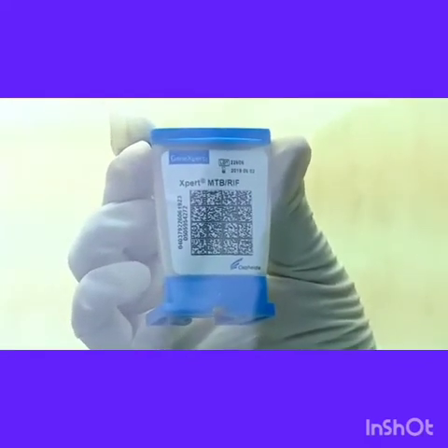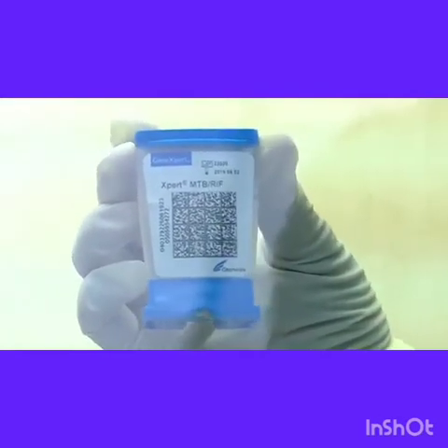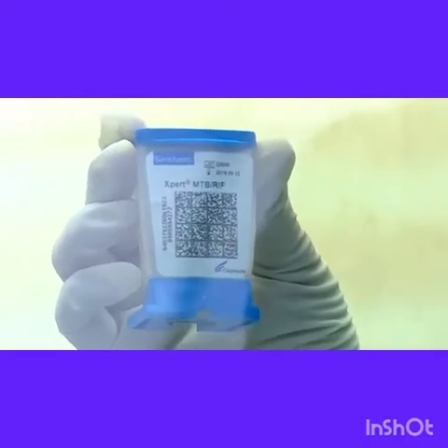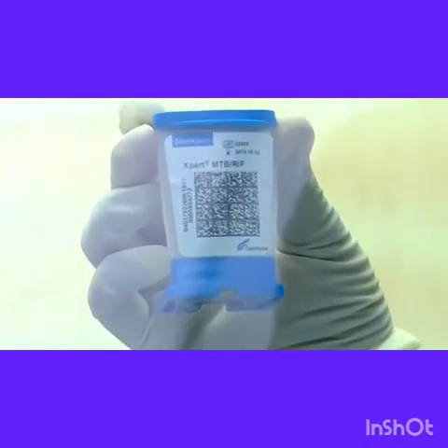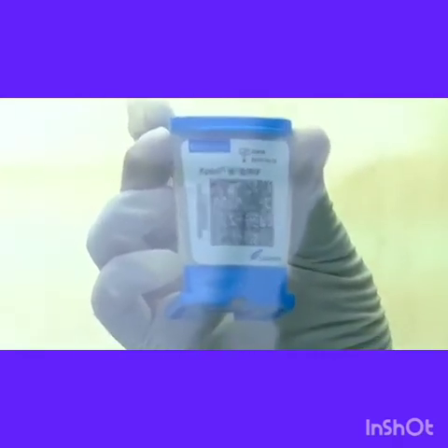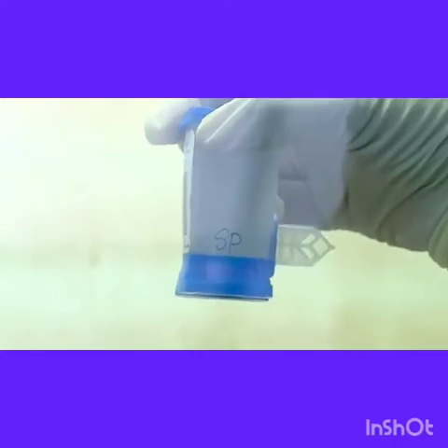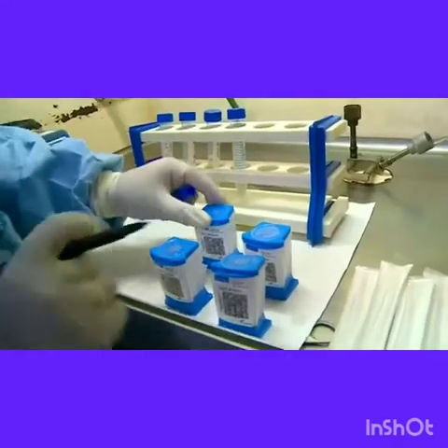Now it is time to label the cartridge. This is the MTB/RIF cartridge which is provided with a barcode. The lot number is also there along with the expiry date. The sample ID or the laboratory number should be written on the side of the cartridge which is provided for labeling.